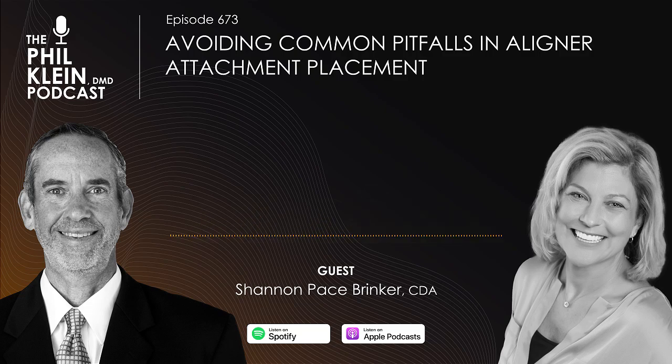to use the same system from the same company, because if you want to troubleshoot a problem and you call the company, they'll blame it on the adhesive if you're using their composite, and if you're using their adhesive, they'll blame it on the composite. So when you're telling them you're using everything, including the curing light, from the same company, in this case Ivoclar, it rules out any kind of incompatibility issue with different manufacturers.